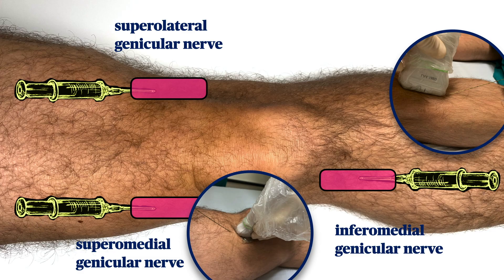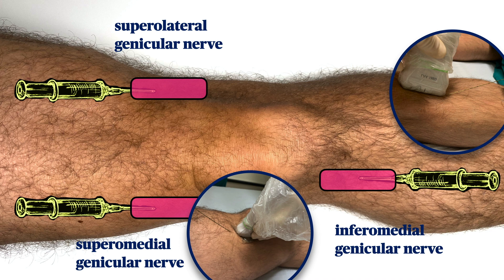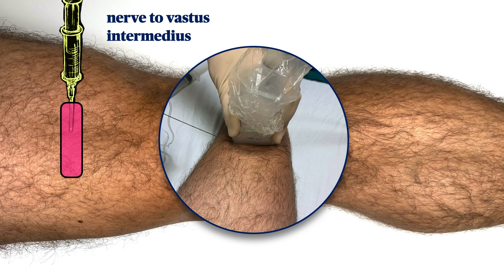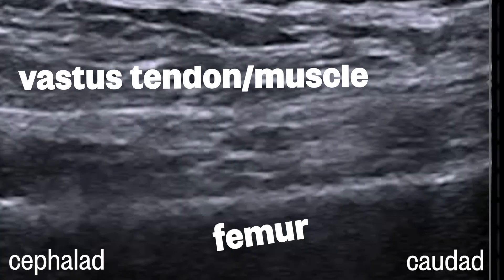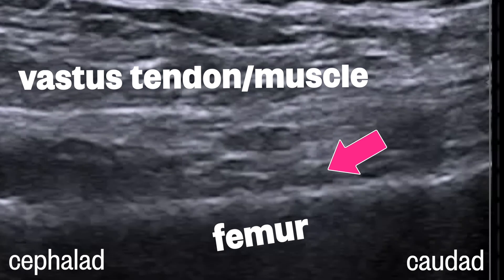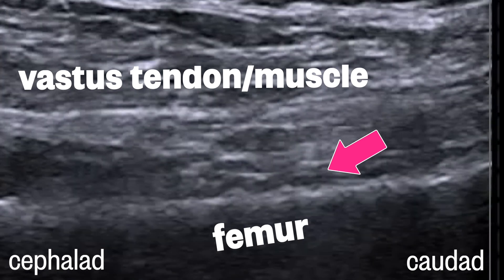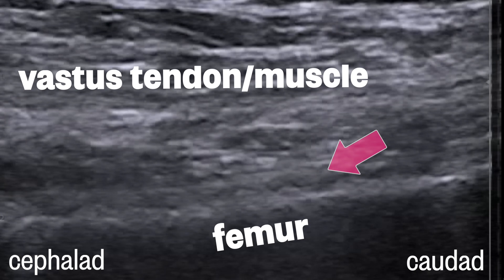Here are the probe positions for the three genicular nerve blocks. For the two superior nerves, the probe is angled at 45 degrees so that you're catching the anterior lateral and anterior medial femur, and in each case the needle is advanced toward the knee joint. For blocking the nerve to vastus intermedius, you're looking for the hyperechoic line of the femur as it flares up to become the epicondyle. A useful landmark is the small genicular artery that can often be seen right where the femur starts to slope up, although it's not always visible.